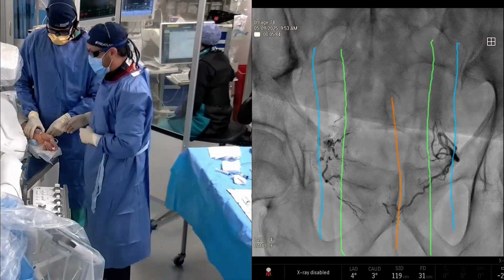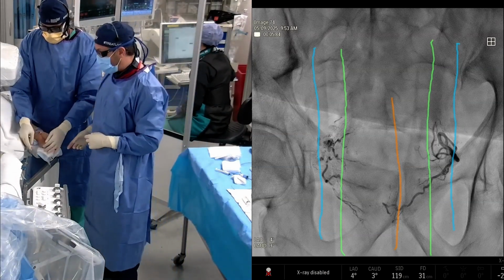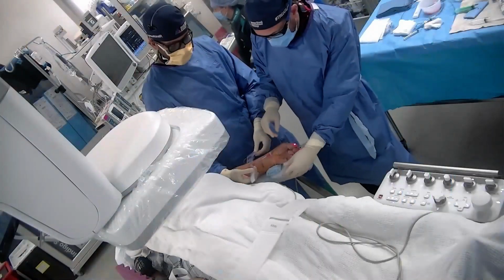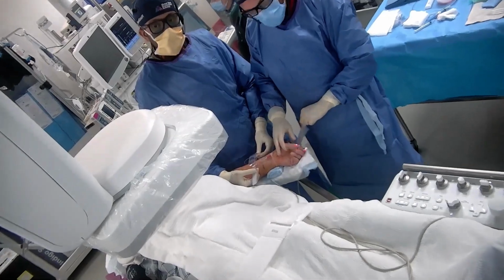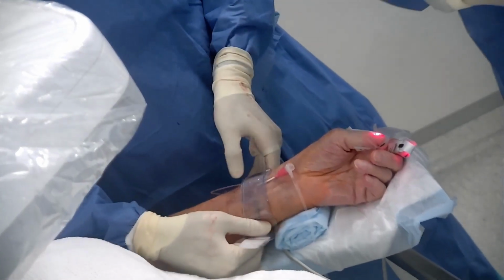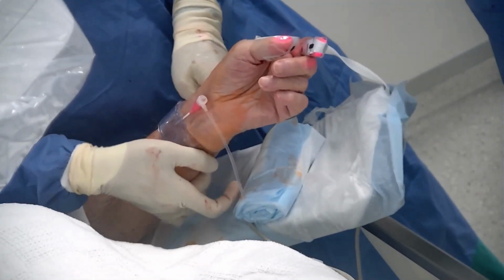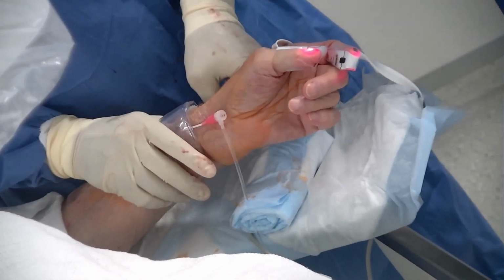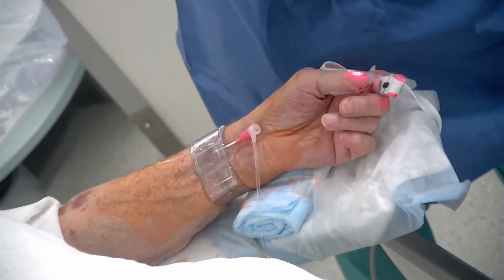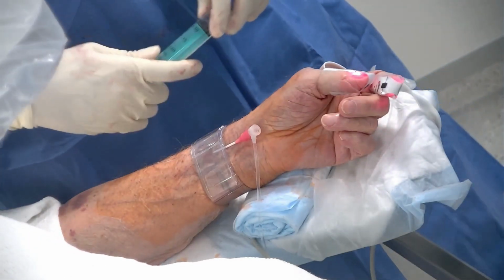We're going to center on the wrist while we do this closure, just so you guys can see. Let's see if we can zoom in on the wrist. We're going to show you guys the TR band, and people who don't use radial access will just show that. So I think radial access helps with our fluoroscopy times. Clearly, not having to fluoro while we inject beads is critical, and so that probably halves our fluoroscopy time, because the majority, at least in this case, the majority of that fluoro time would be watching our beads and making sure they're not going into non-target areas. And so the visualization that we get with glue really shortens, and obviously the speed shortens our fluoroscopy time quite a bit.